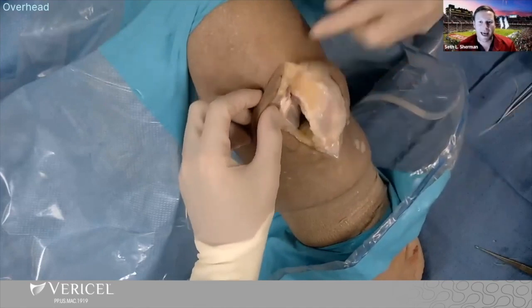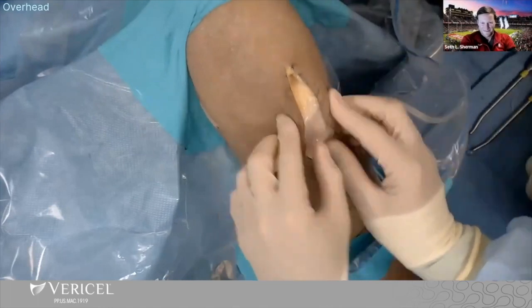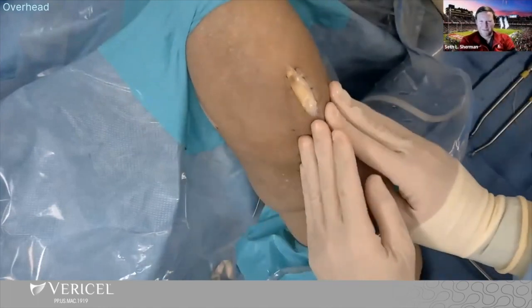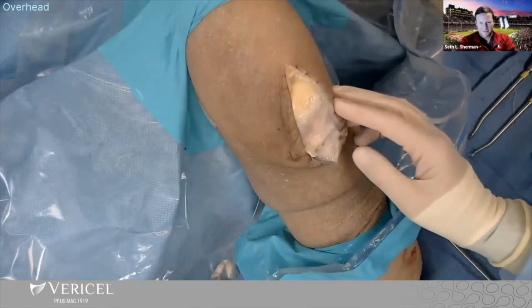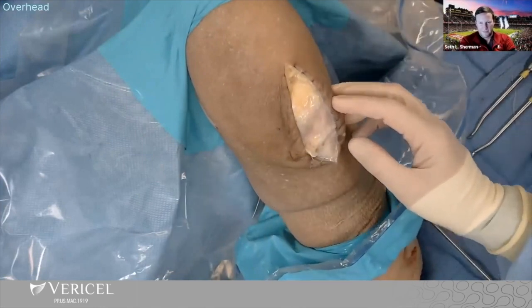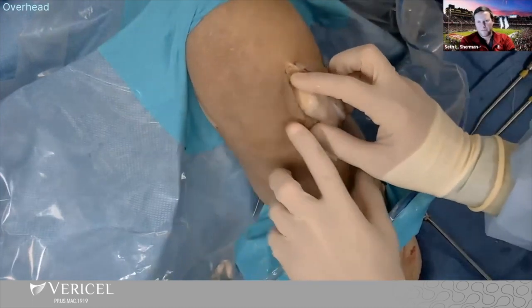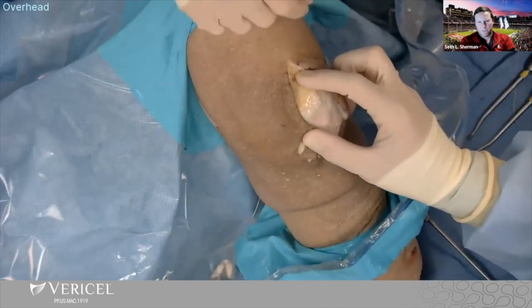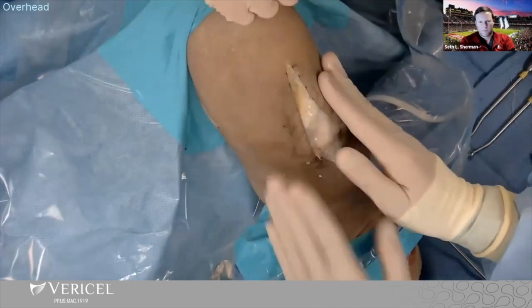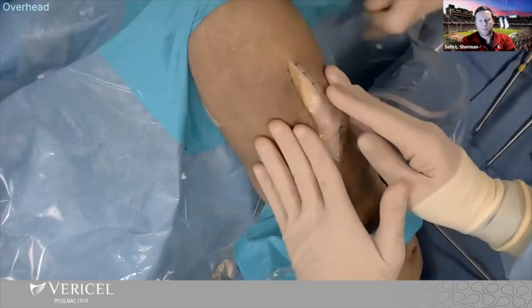Do you go medial or lateral for this approach? So I always go midline. A lot of people do through the medial portal or lateral portal — I started doing that early on. But what I found was, for cosmesis, the incision — even if you put a straight incision, a little flexion or extension tends to curl it a little bit, and patients thought that was unusual. I like the midline because a lot of these cartilage patients, this may not be their last procedure, so I like this midline approach.